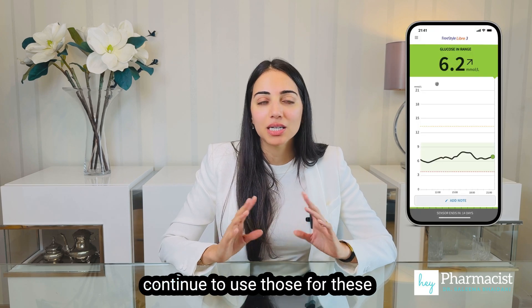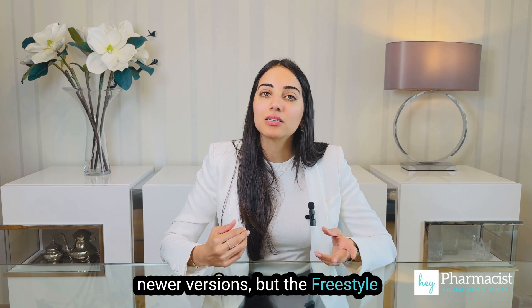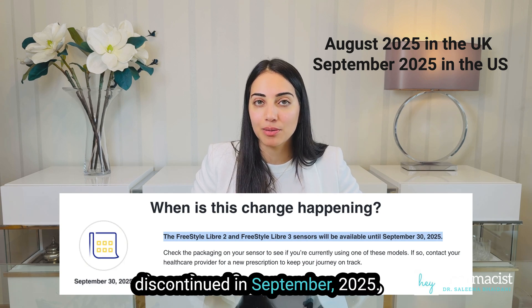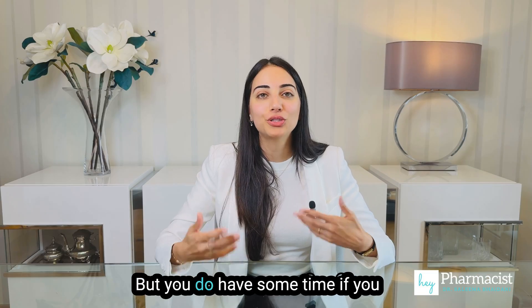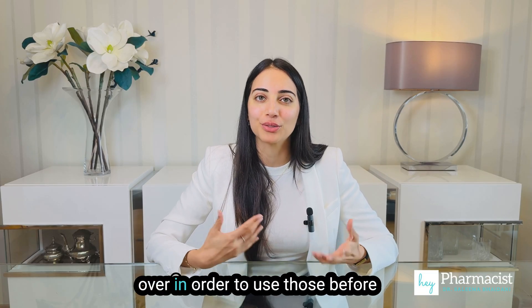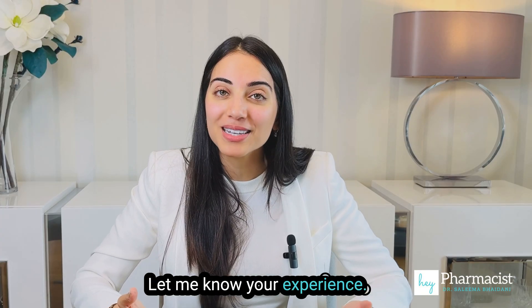You can continue to use the apps for these newer versions. But the Freestyle Libre 2 and 3 will eventually be discontinued in September 2025. So if you haven't already got the Plus versions, you will need a new prescription for them. You do have some time if you still have your Libre 2 and 3 left over to use those before you switch over to the Plus versions.